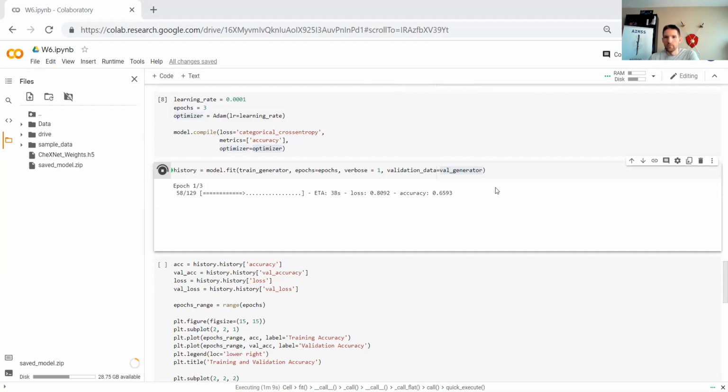So where to find pre-trained models such as ChexNet. For example, looking for a pre-trained model for echo images. Well, if you can find a paper that is describing a model that's already worked for echo images, sometimes they'll provide links to their data, links to their model.